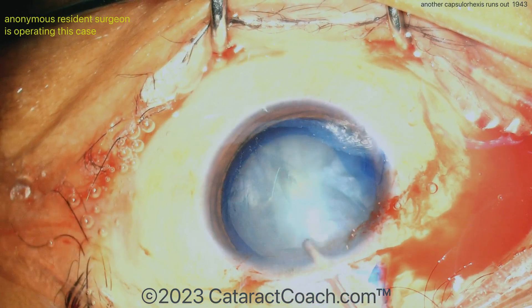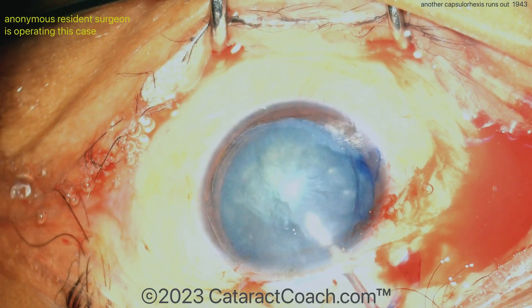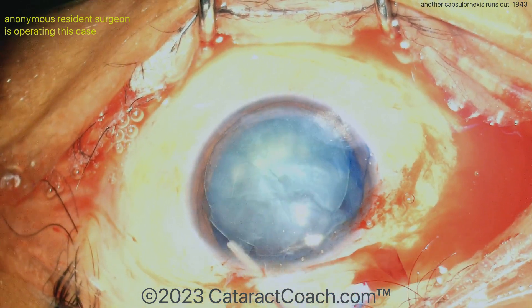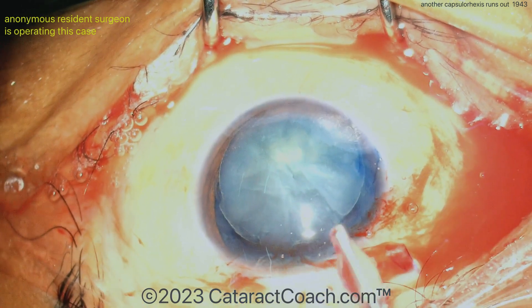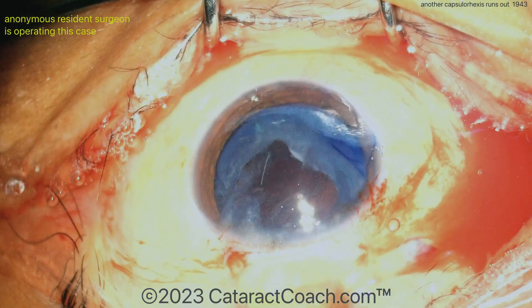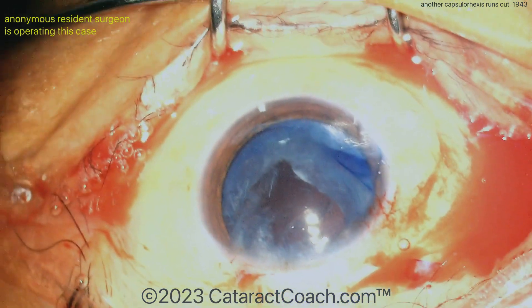Here's some hydrodissection. Doesn't look like a very dense nucleus, so that's also a good sign. Get that nucleus above the iris, a little more viscoelastic underneath it to protect the capsule, and then bring it outside the eye. Pretty soft nucleus — I would have preferred to use a phaco probe for this type of nucleus.